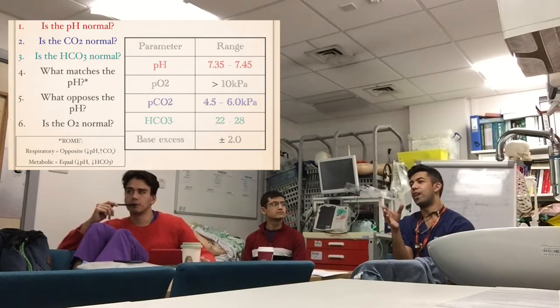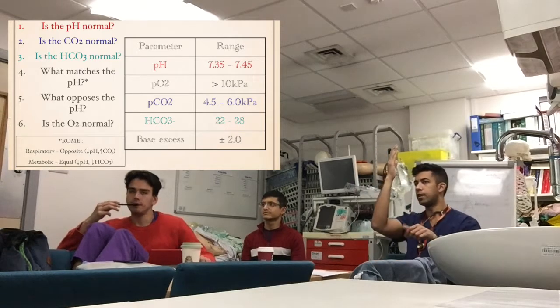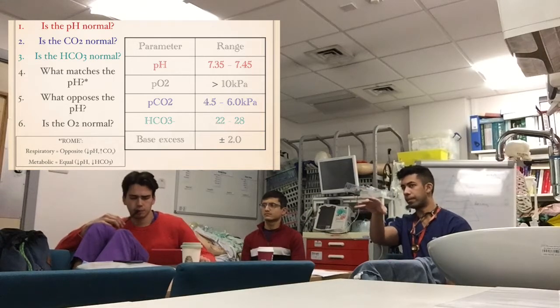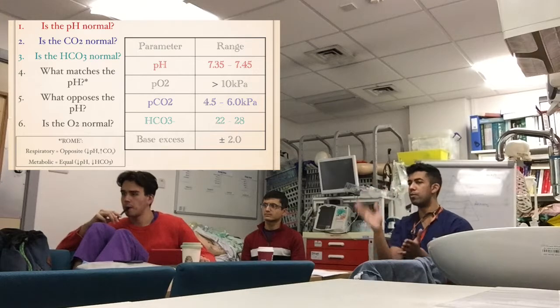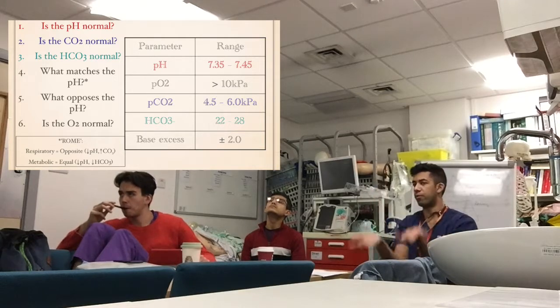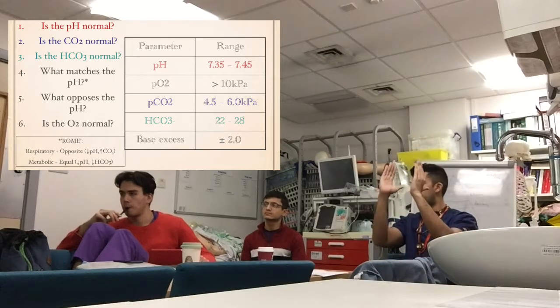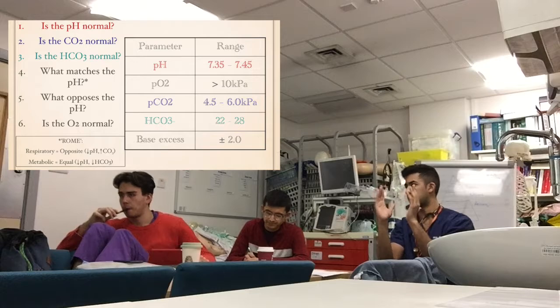If the respiratory is going the opposite way, i.e. the carbon dioxide is high, then its correlation's opposite, isn't it? That means it's telling us a respiratory thing. But if you're looking at both numbers going in the same direction, so say you've got the pH going up, so it's like a 7.5, and you've got the bicarb going up as well, they're both moving in the same direction, that's telling you it's like a metabolic alkalosis. That's telling you the relationship between them, purely numerically.